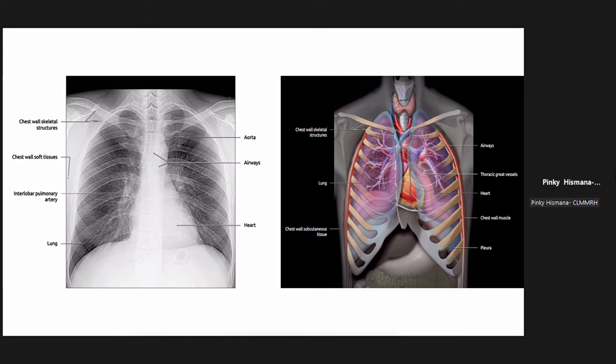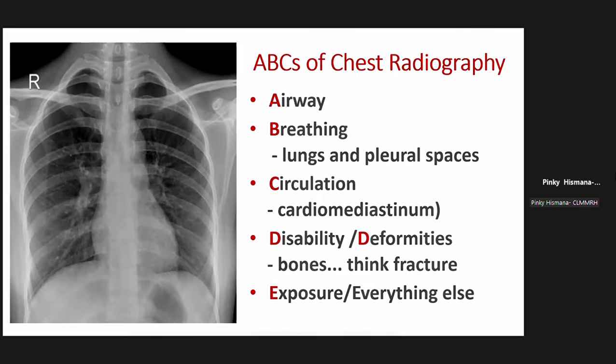It's not only the lateral view which is available for us. We can also do oblique views, which are quite seldom used lately, but at times we still use them. I'm not going to discuss them with you anymore, because usually if oblique views are needed, the radiologist would suggest them in their remarks. That would already help you in making a follow-up request or an ancillary request.